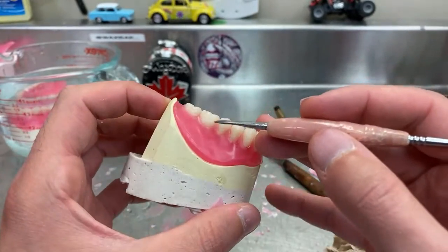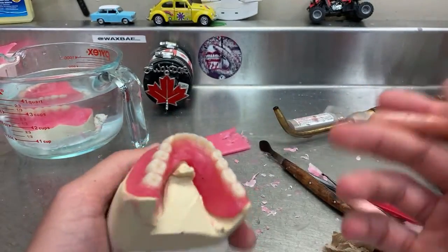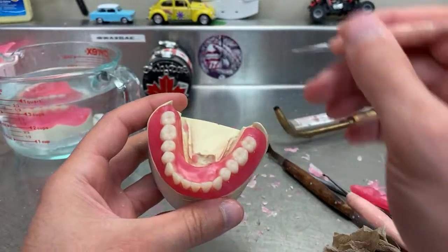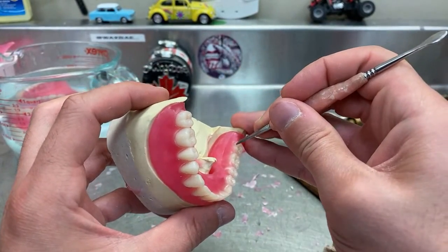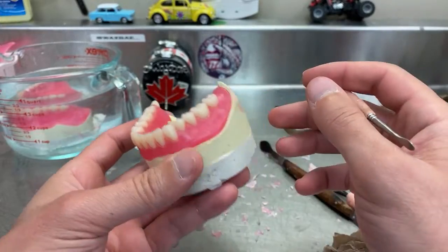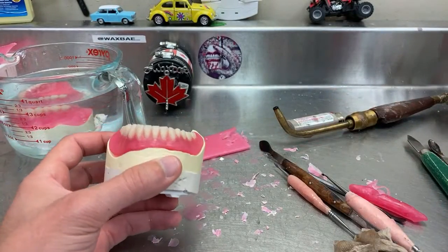I usually don't even carve this. I just did this to show you. I only carve the 6 anteriors, but now I did that just to show you. It's going to try in and it will come back, and then on the finish wax up, which I do after it comes back from the try-in, there's a touch-up that I do on everything if there's anything that changed or got destroyed.